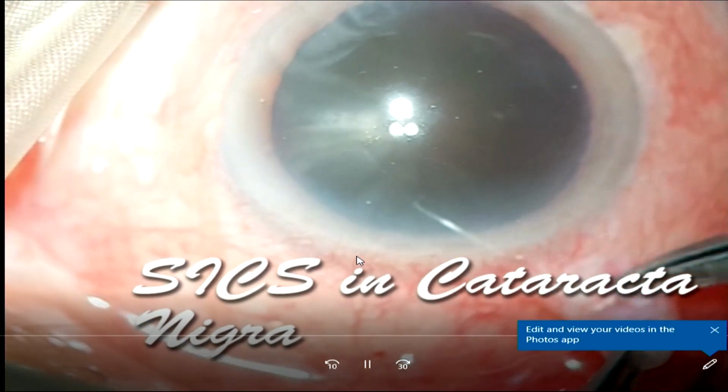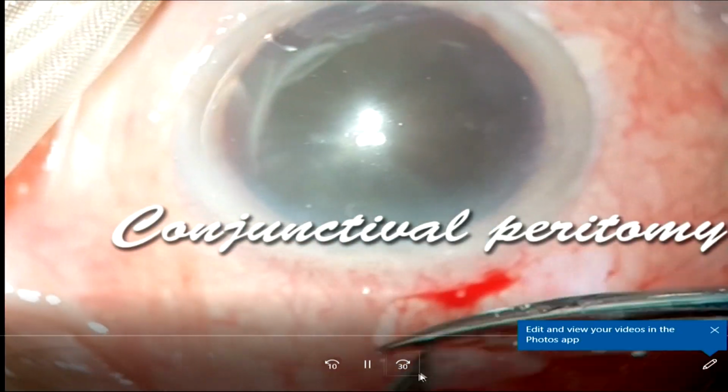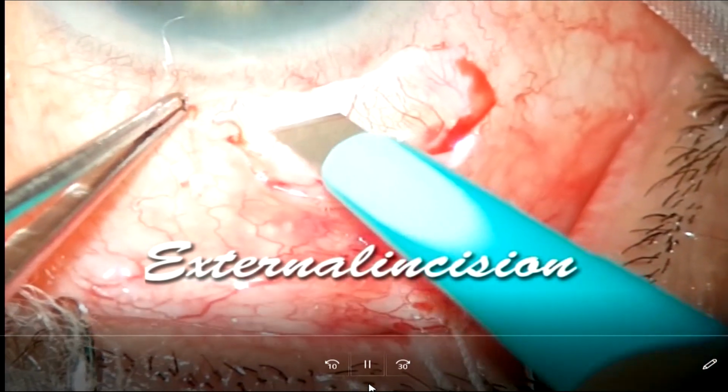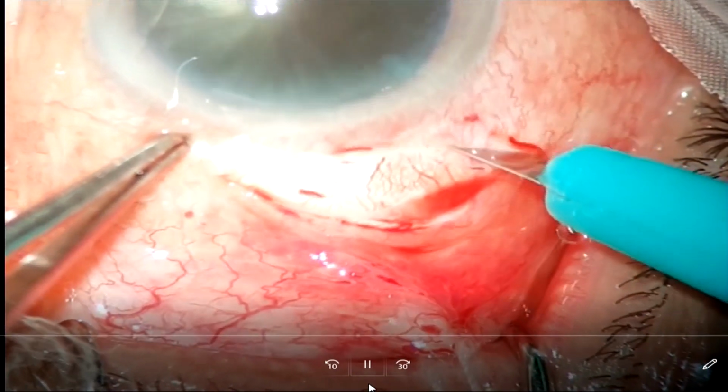So this is a cataract nigra, and nowadays what I do is I leave a frill of conjunctiva near the limbus so that you don't harm the stem cells. It also helps in closing your wound properly. The wound gets covered by it.